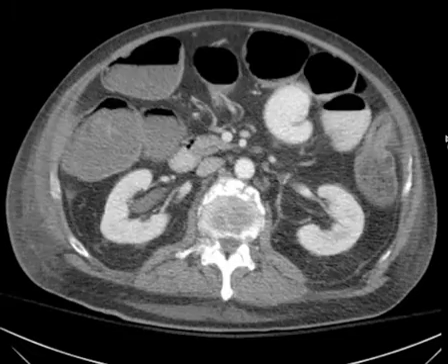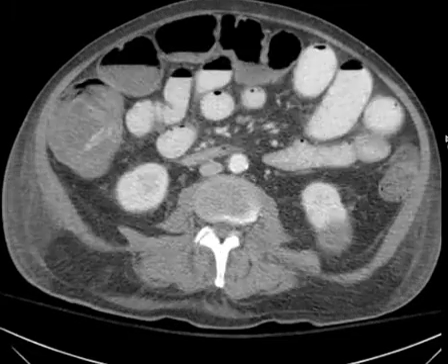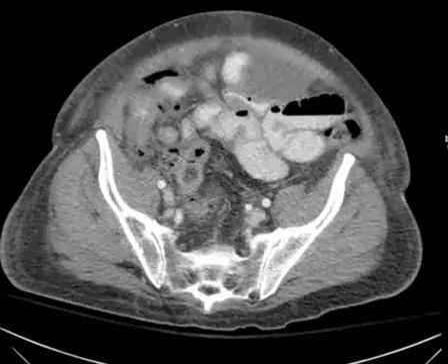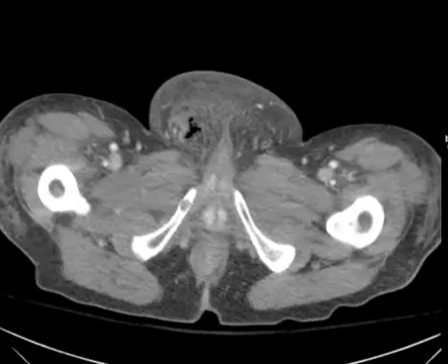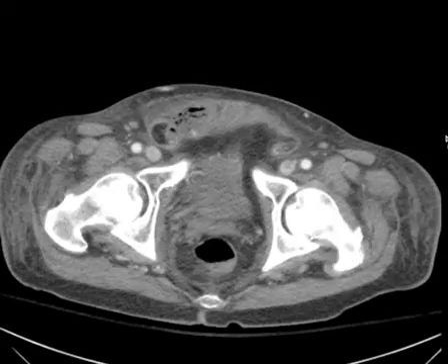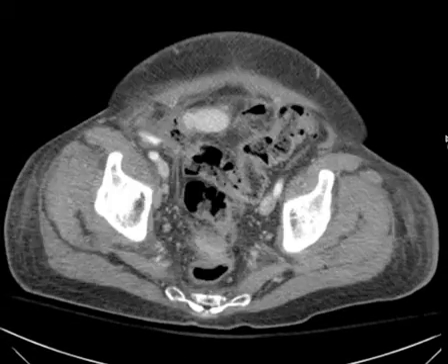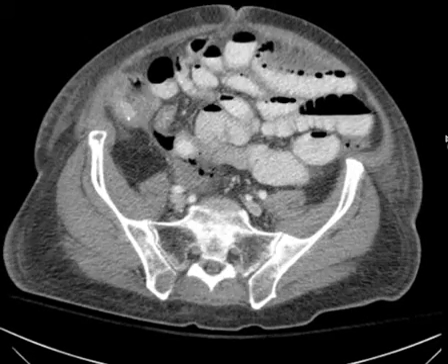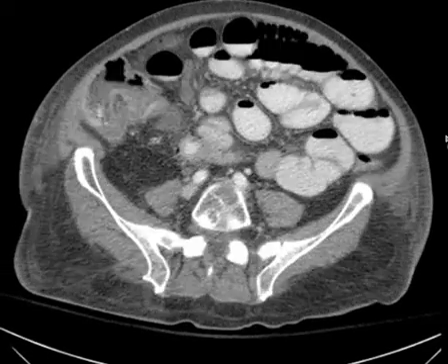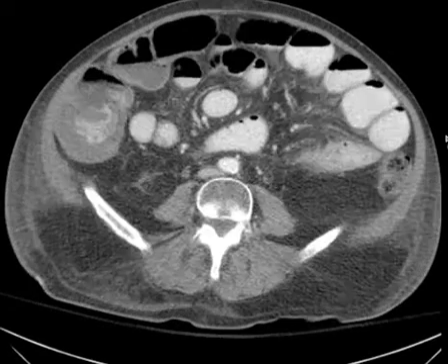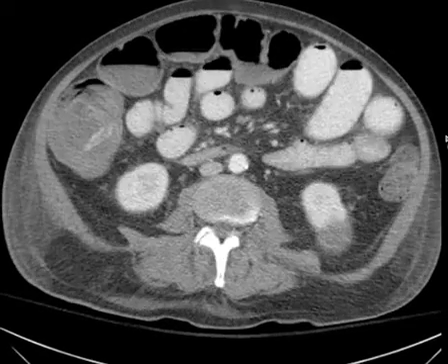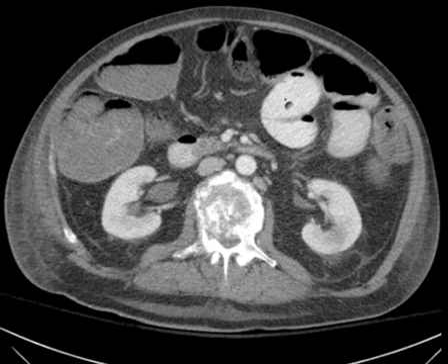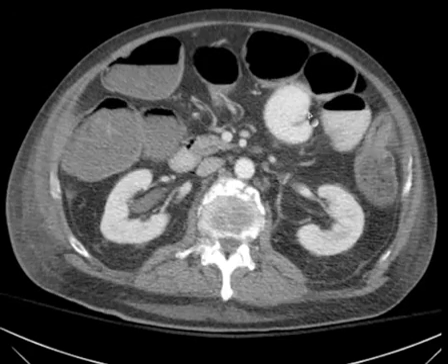So, severe abdominal pain — take a look. There's kind of an overview of what's going on. Now take a look, tell me what you think. This bowel looks a little dilated; they're probably getting close to three centimeters in diameter.